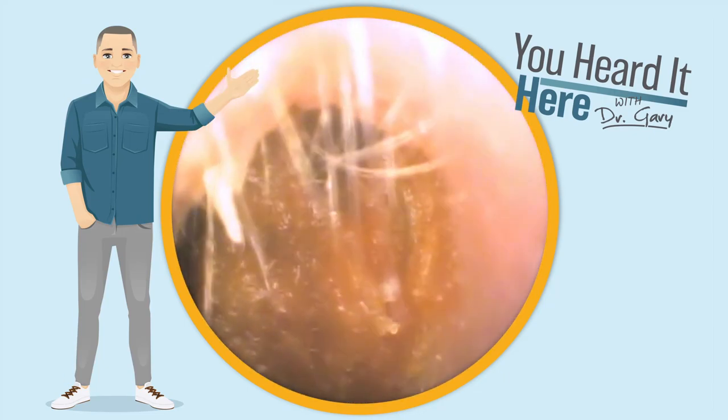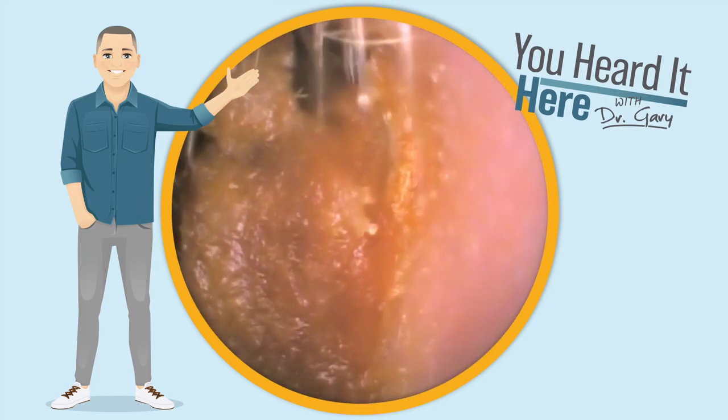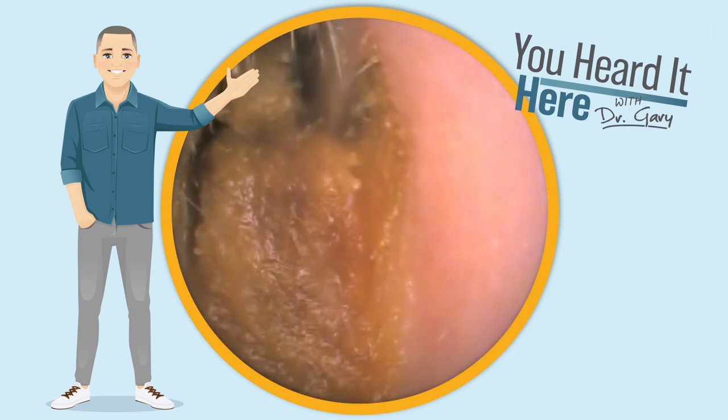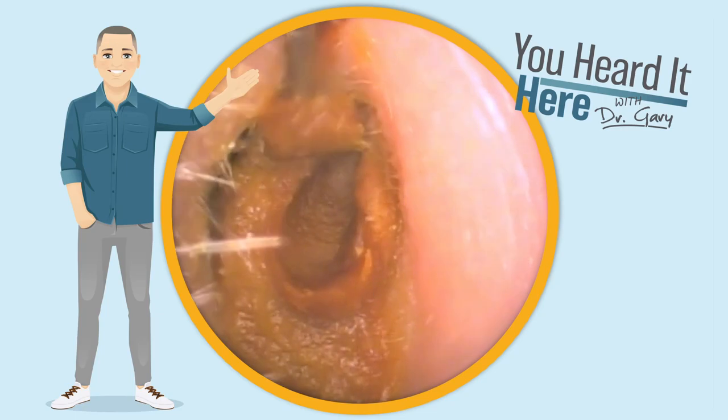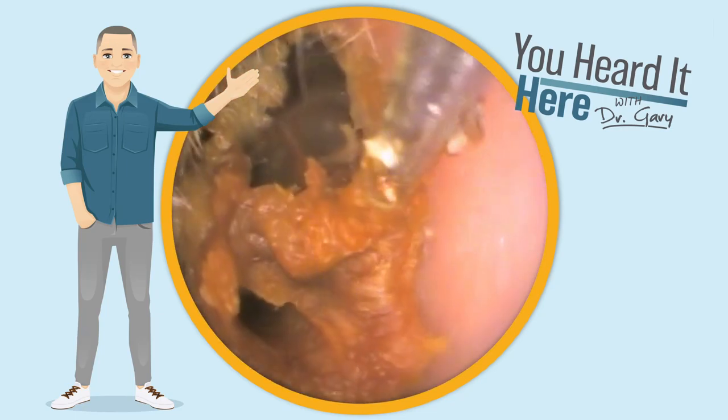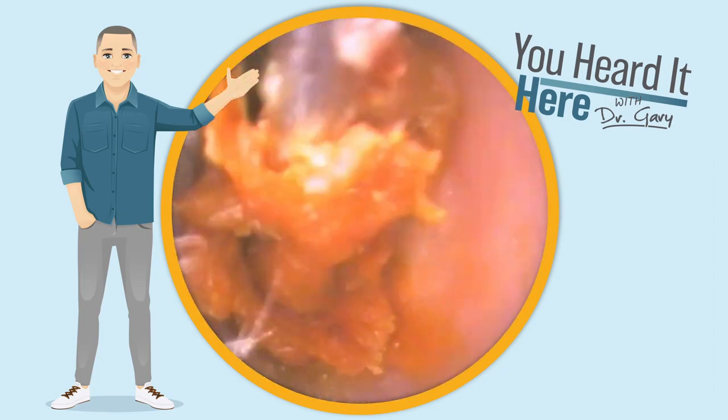Welcome back to 'You Heard It Here' with Dr. Gary. In our last video we looked at this patient's other ear and it was a mess — we needed to use both the curette and irrigation. Let's see if we need to do the same thing on this side. As we start using the curette, you can see how this wax is kind of flaking off and coming apart.